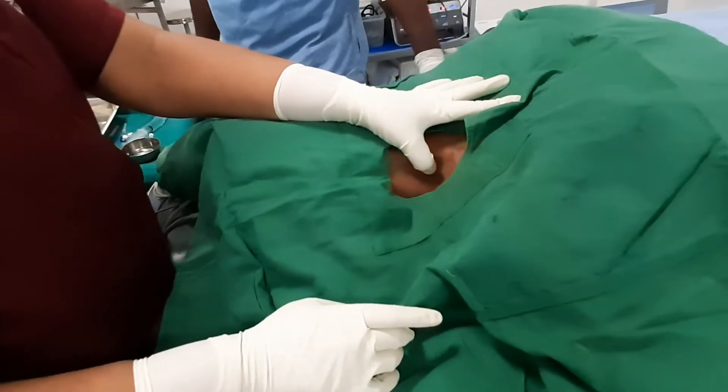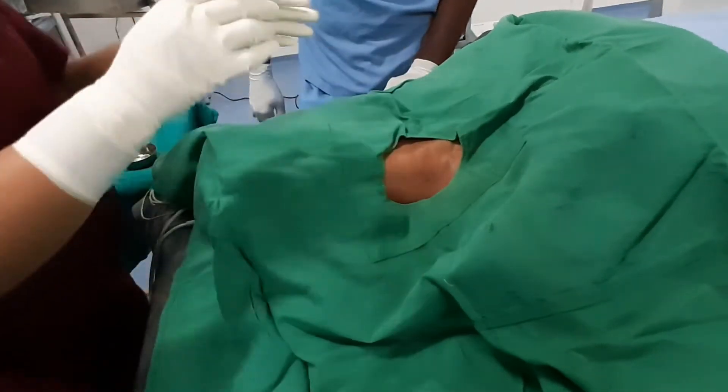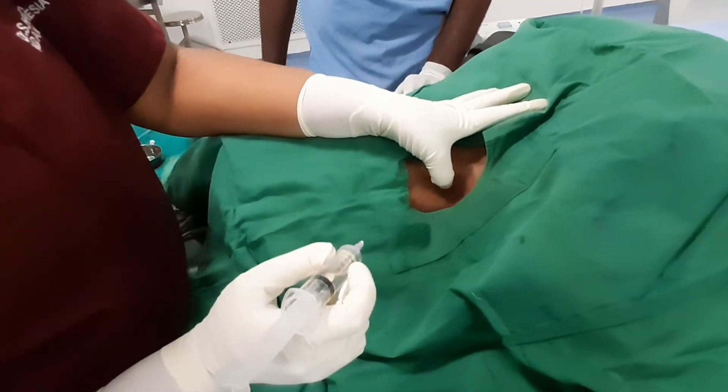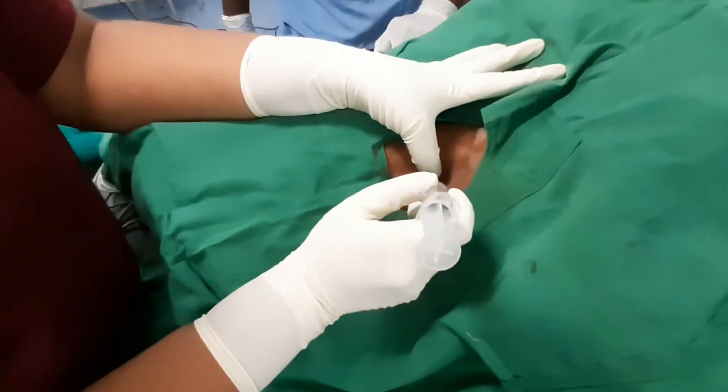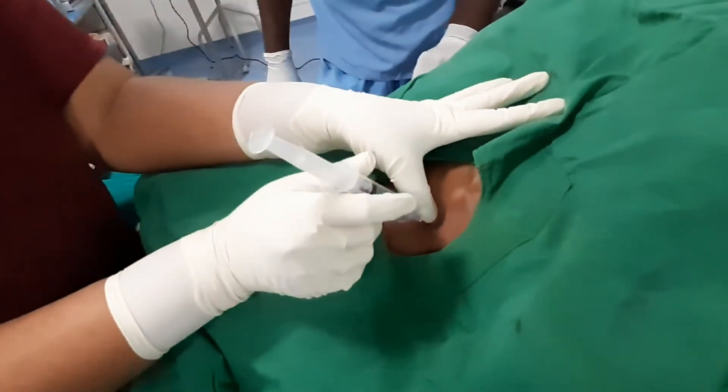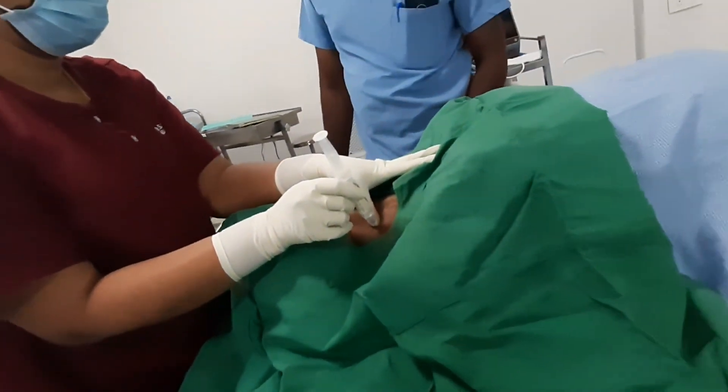Ask the patient to lift the head, identify the posterior border of the sternocleidomastoid, and palpate the interscalene groove. From the line drawn from the cricoid cartilage, insert the needle at a 45 degree angle about 1-2 cm. The EJV may overlay.